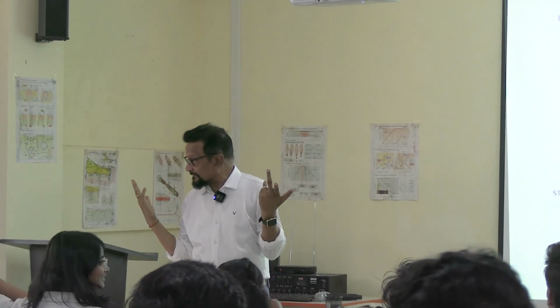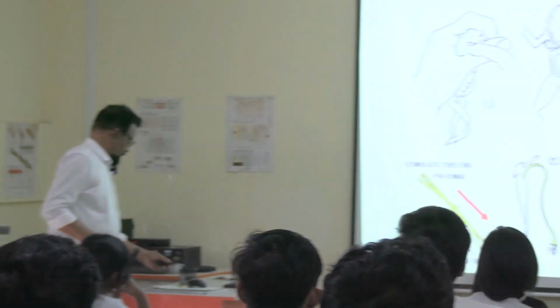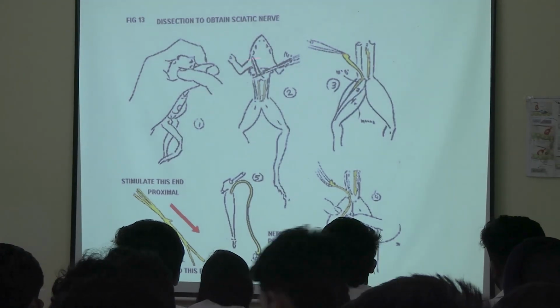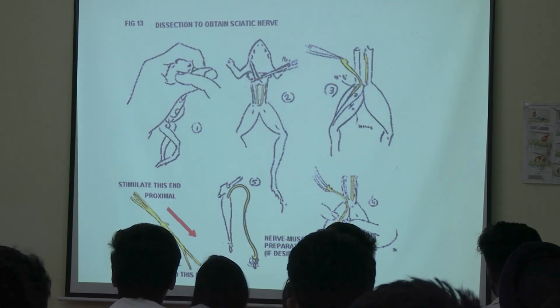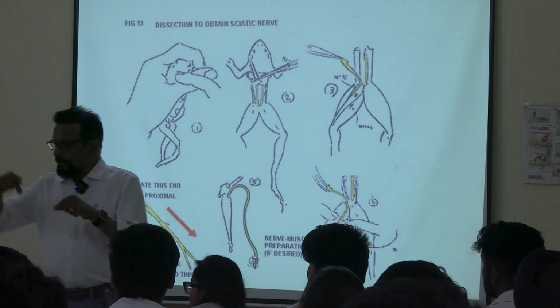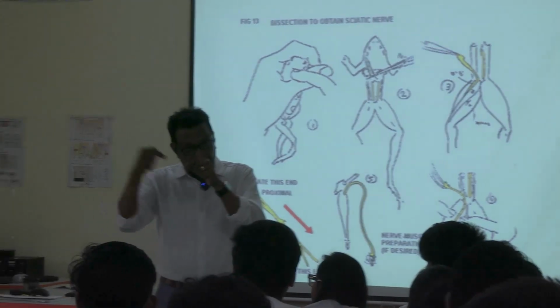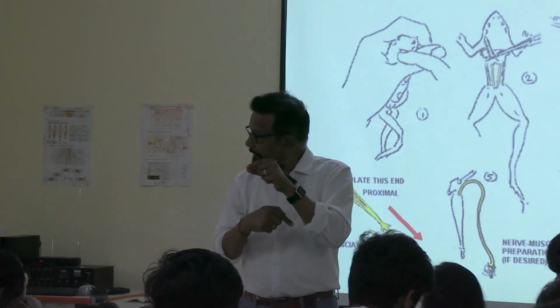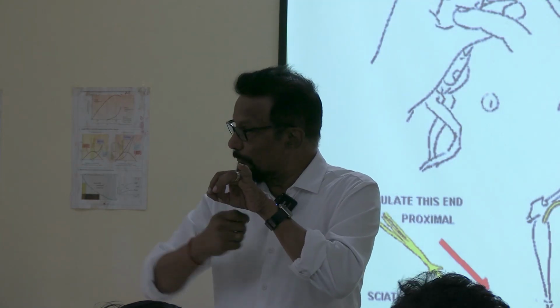It will become senseless. So you can see this is stunned. Now at the back of the head there is one area, here it is. From there one needle is inserted to destroy the spinal cord. It will be passed through the vertebral column. Within the vertebral column there is the spinal cord, so it will be destroyed.